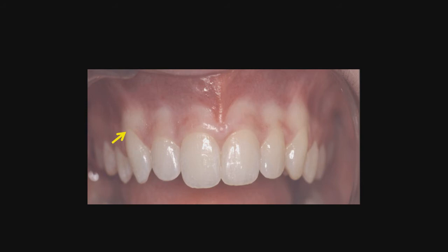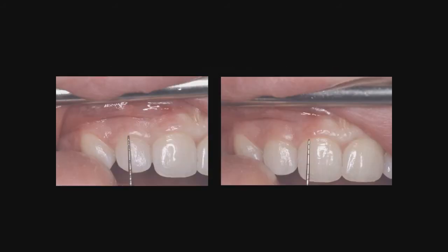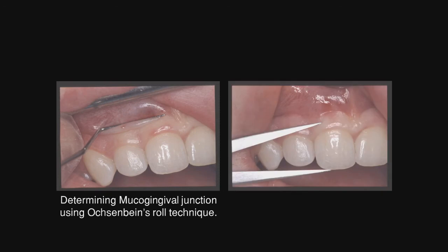As we look at this lateral incisor, the length of that tooth is 7 millimeters long, and it should be 9 millimeters long. Whereas on the central incisor, the distal of that tooth should be 11 millimeters long, and it's 9. Here we're using a caliper to make the bleeding points.